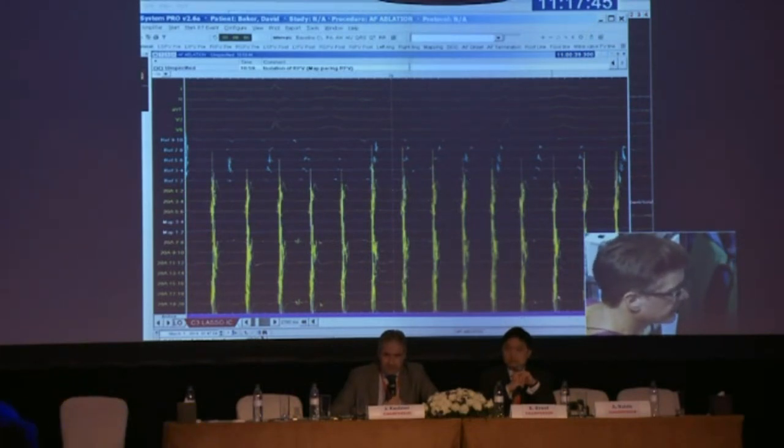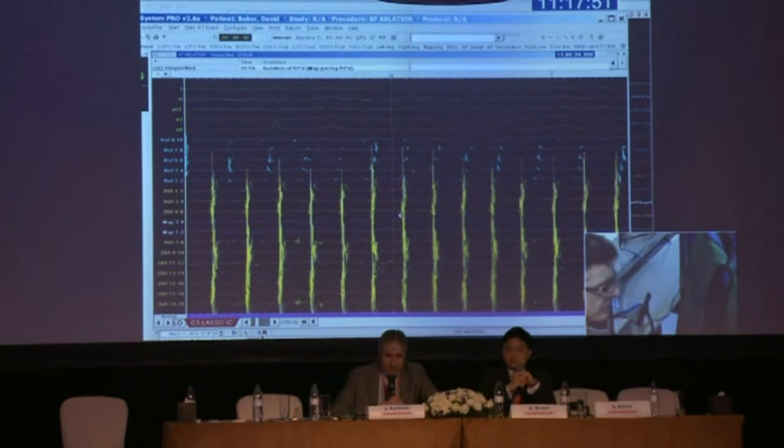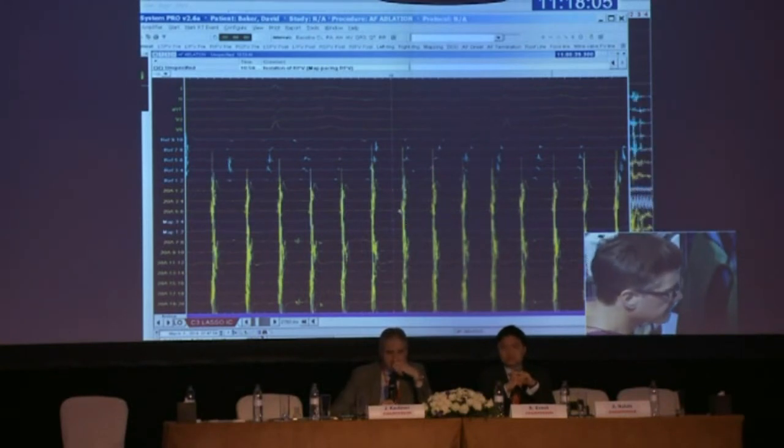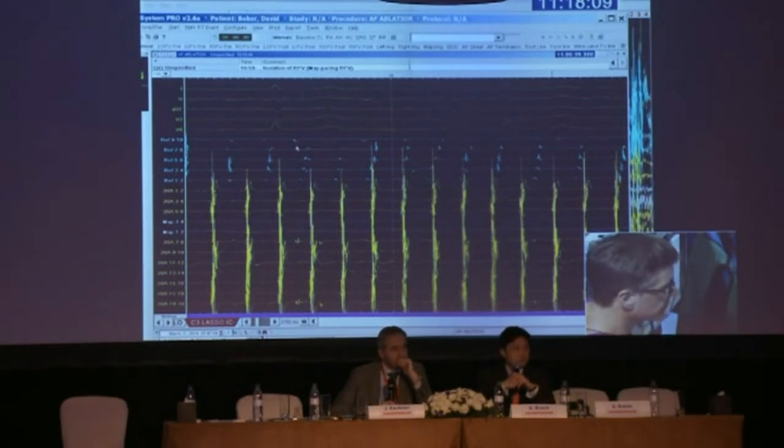And we can see that the PV 5-6 is the earliest PV. And when we were looking at the PV in the appendage, 5-6 was on the anterior aspect of the appendage. So I knew that whatever was fastest in that atrium had to be near the PV, on the anterior wall, not near the CS distal, and not near the CS proximal and the septum.